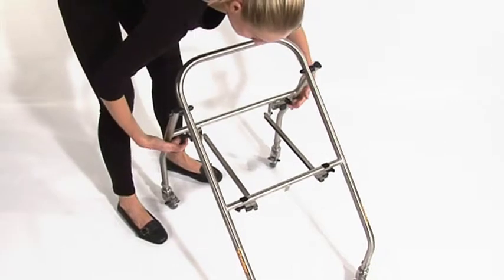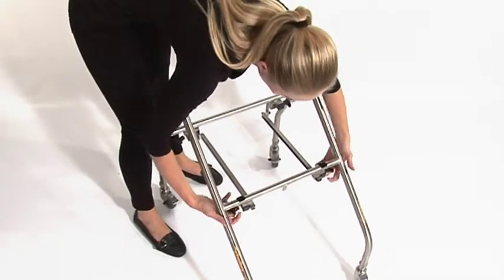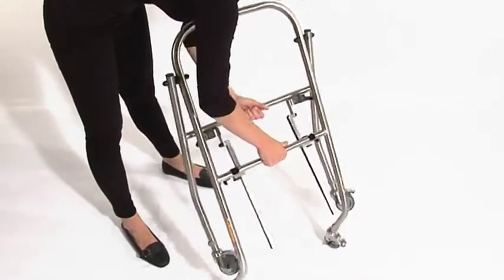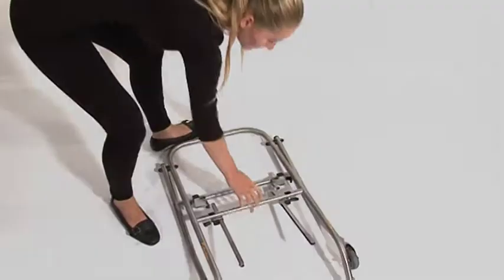To collapse the mobile frame, pull the spring plungers located on the front of the mobile base until they can be angled and locked into a disengaged position. Then lift the rear of the frame.